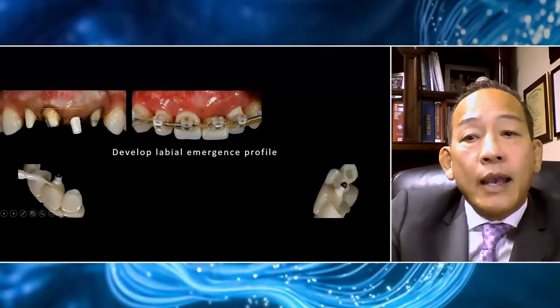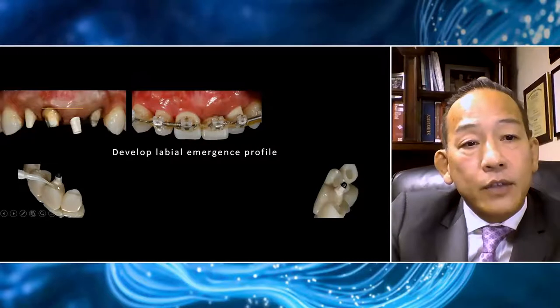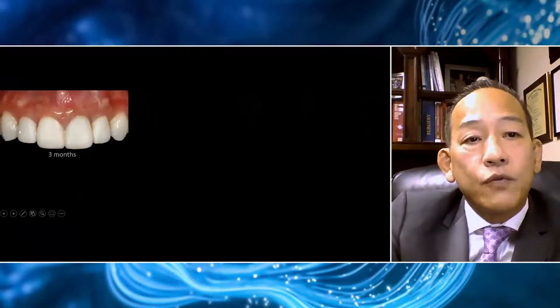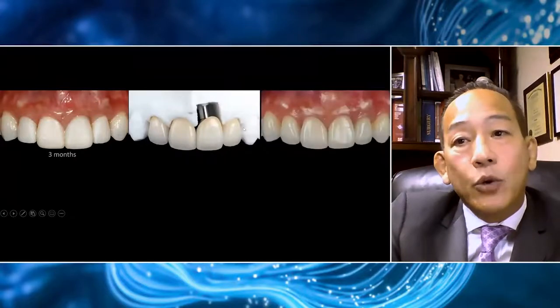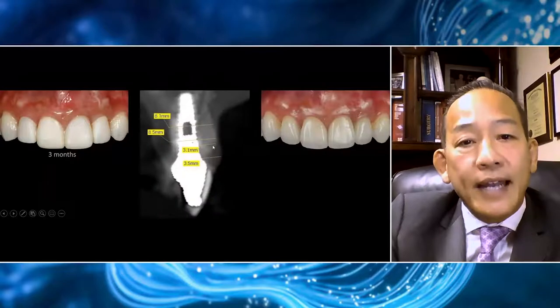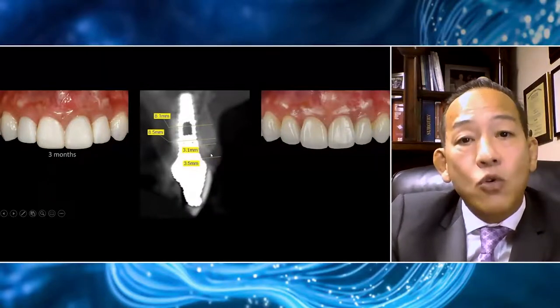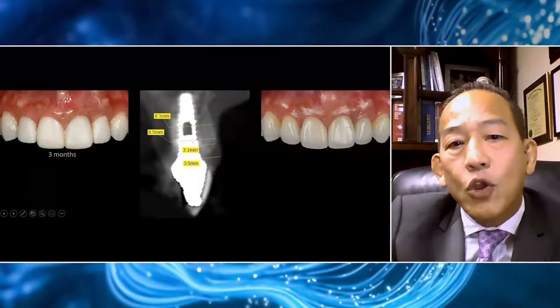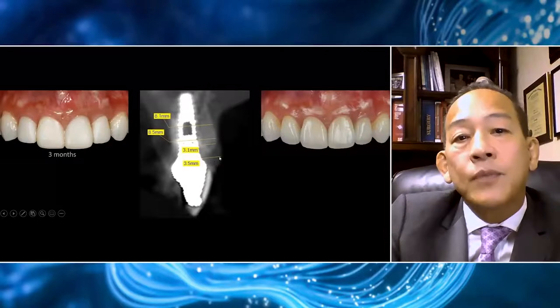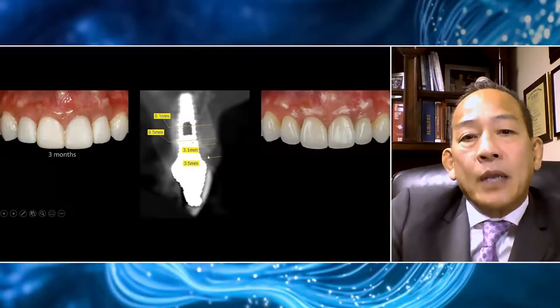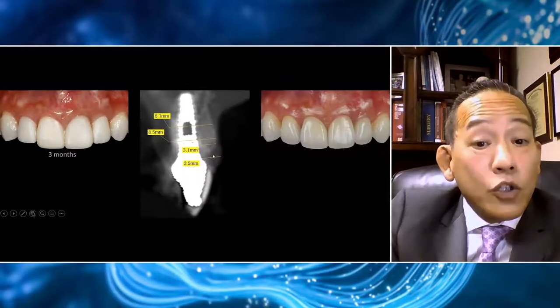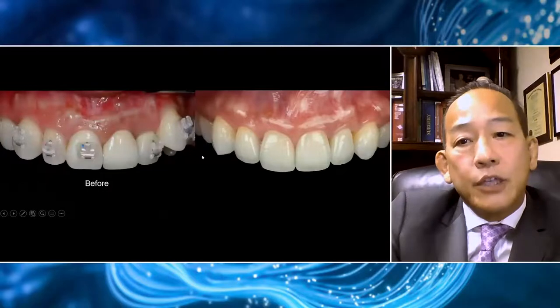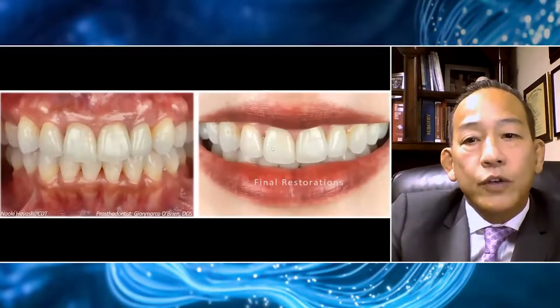Our prosthodontist, Dr. Gianmarco O'Brien, uses flowable composite to essentially displace the soft tissue apically, and you can appreciate the gingival margin symmetry at that point. The final restoration was fabricated by our lab technician, Naoki Hayashi. Because we achieved a very nice buccal crest — a high crest — we are able to transform the soft tissue. The soft tissue was only one and a half millimeters thick, yet without tissue augmentation it is now three and a half millimeters thick. I call this concept bone-driven tissue regeneration — we're developing tissue height and tissue width. You can appreciate the aesthetic result and the beautiful restorative work done by our team.